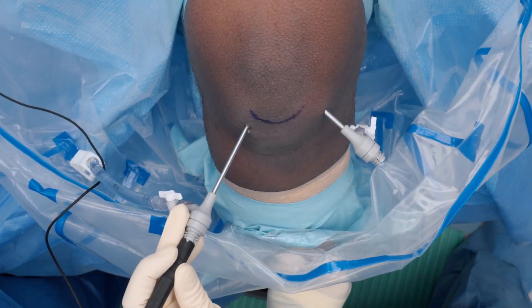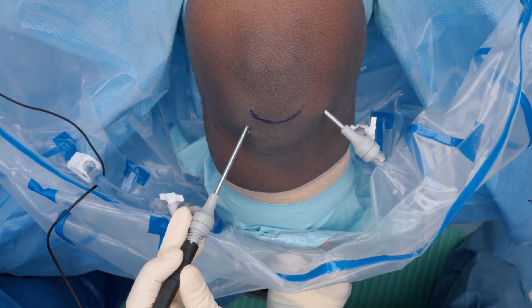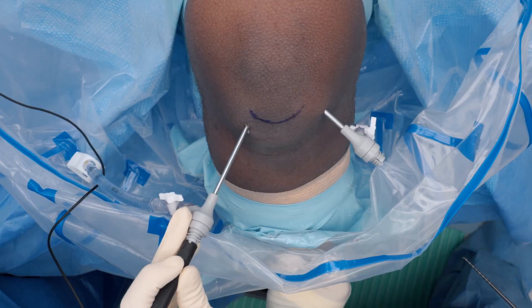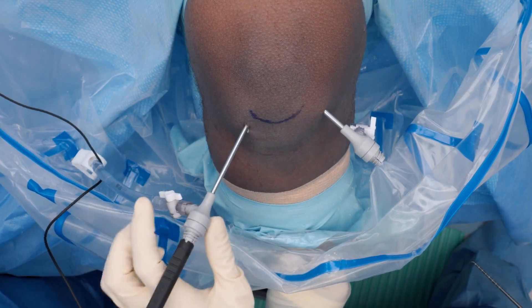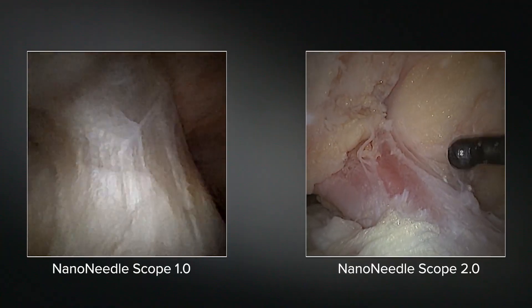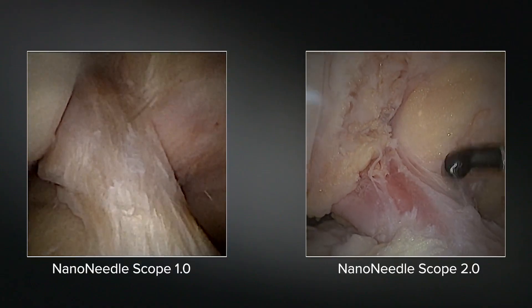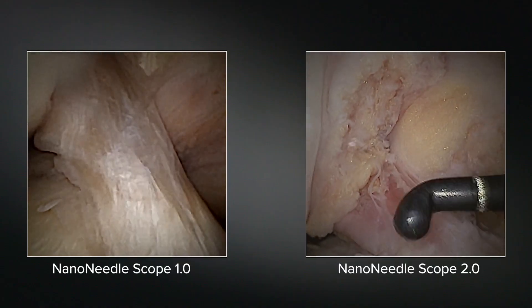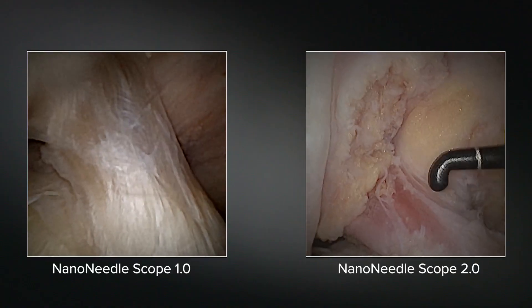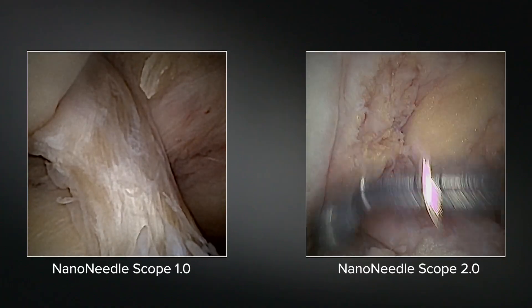Now we're going to be taking our new Nano Needle 2.0 for a drive. Starting just outside of the knee — you can see I'm holding it toward the back. This is the same handle as the 1.0. I prefer to hold it at the back handle, but others will prefer to hold it closer to the knee, which gives you a bit more control. Starting our diagnostic arthroscopy here, compared to Dr. Frank's video shown right next to me, you can see the colors are much brighter, the definition is much better, and it really focuses on the anatomy we're analyzing and not so much the foreground.